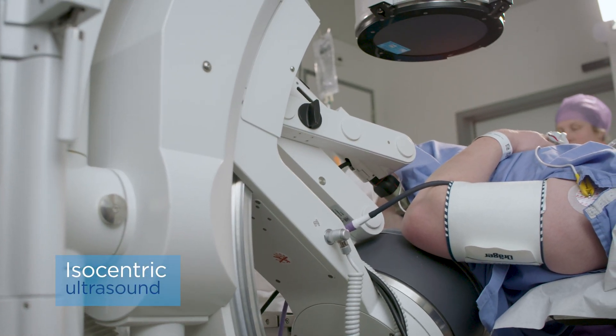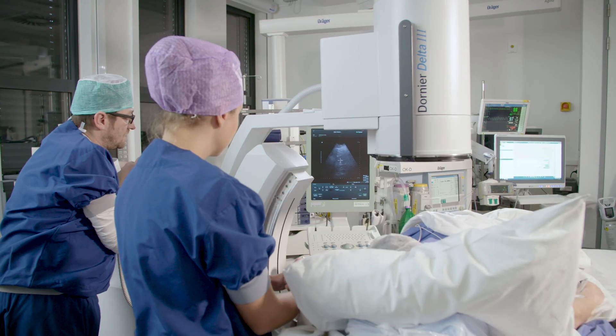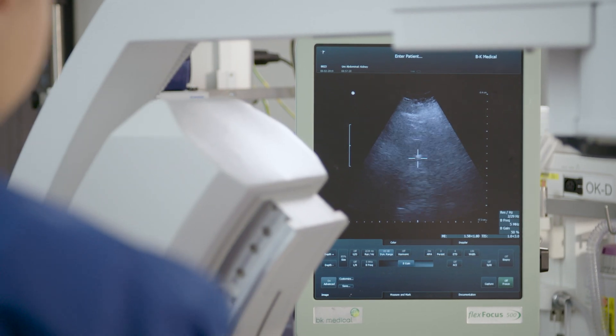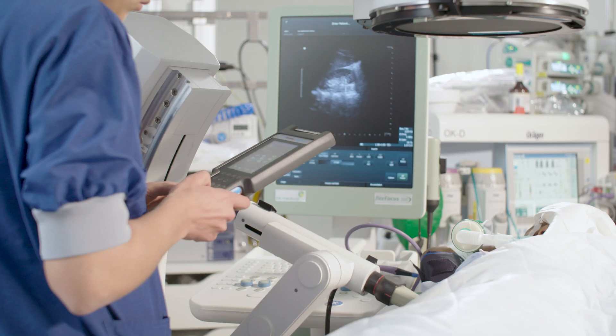The isocentric ultrasound function provides us with a big variety of possible angles to view the kidney stone. This is very easy to use because we can use real-time imaging to ensure that the stone remains in focus during the procedure.